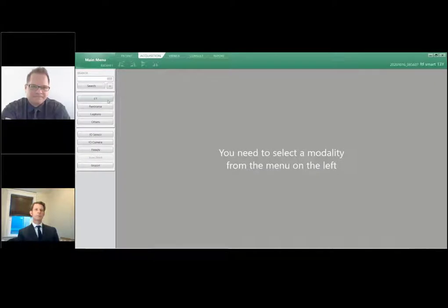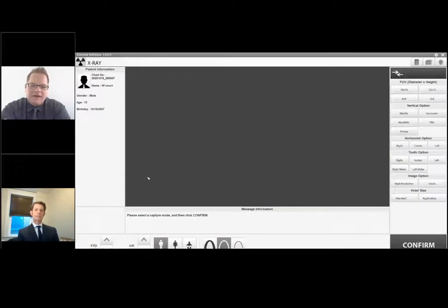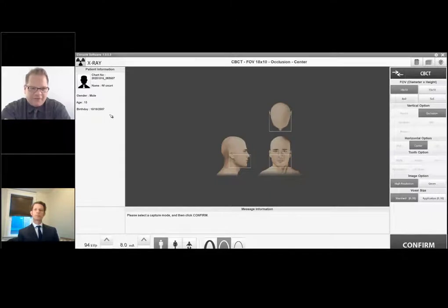It's really simple. It's going to take us into a similar acquisition screen. All the options on the left and bottom are exactly the same as the 2D. So we have the names, the sex, and the density there on the bottom. The only difference here is we're selecting the size on the right. I'm sorry, we select the size first and hit confirm, then get our patient. So back up a second, sorry about that.